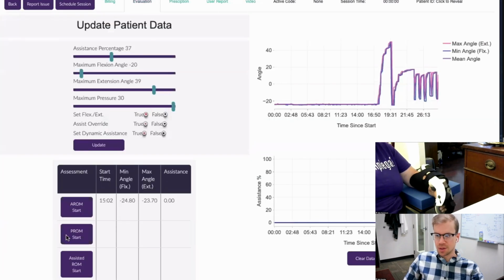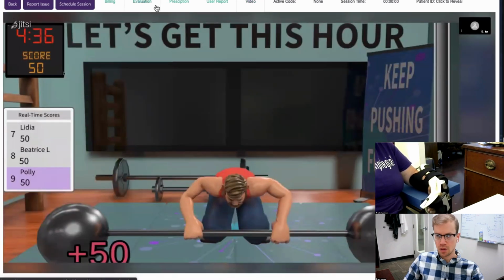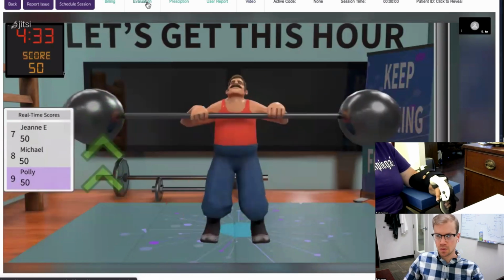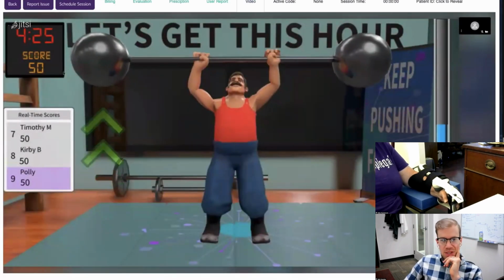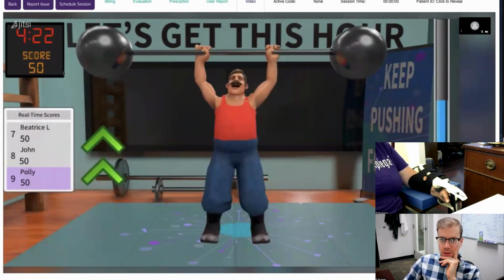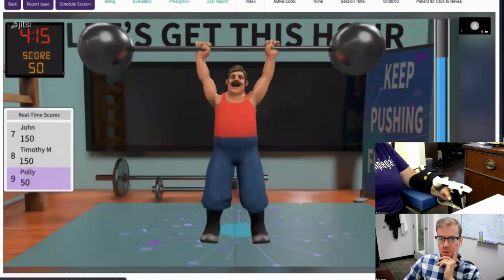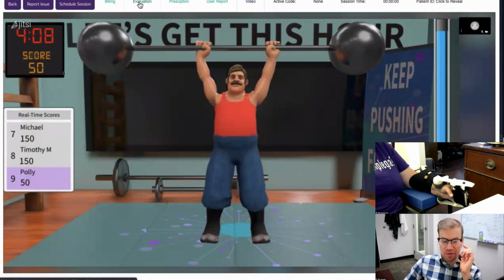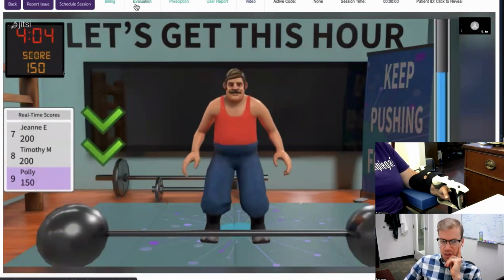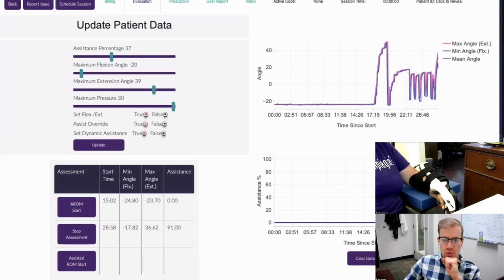Now, how would you rate this now as compared to previously? I think it feels more difficult. More difficult, okay. It is going to be harder because I did increase those ranges of motion, so that's very expected. And I'm thrilled about that. Okay, very happy. Yeah, it's a big change because it's going from about 25 or 26 to around 40. So it is a sizable change, but again, I want to make sure that you have access to that range of motion so you can practice in it. So that's a really important thing we needed to make an adjustment for.